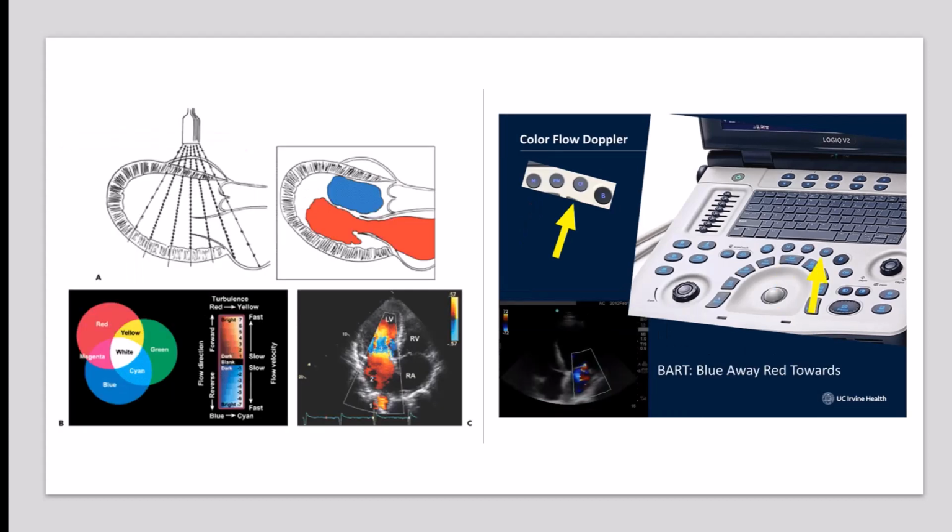Color flow Doppler is used frequently in sonography to semi-quantitate overall blood flow to a region of interest. Depiction of the general velocity and direction of flow within the heart and blood vessels is of primary importance in echocardiology and vascular ultrasound, respectively.